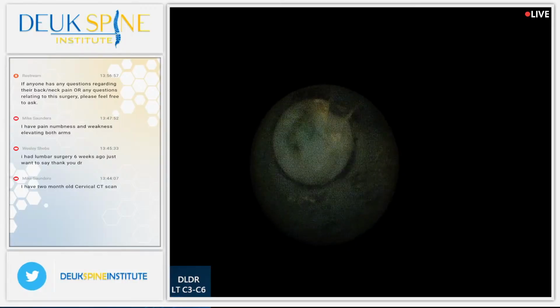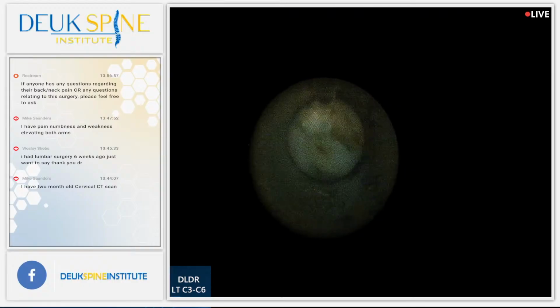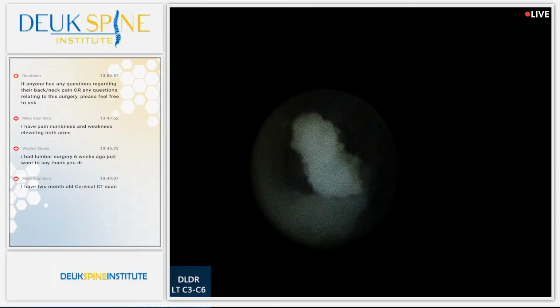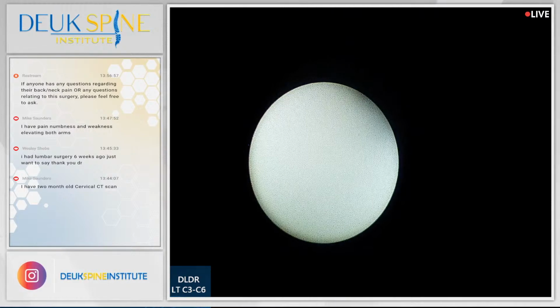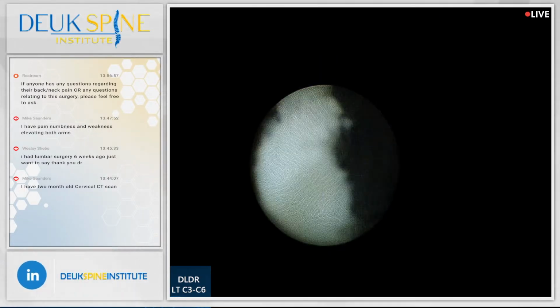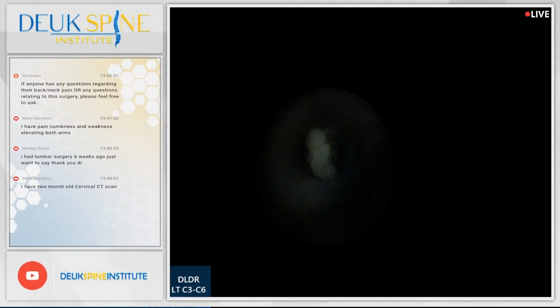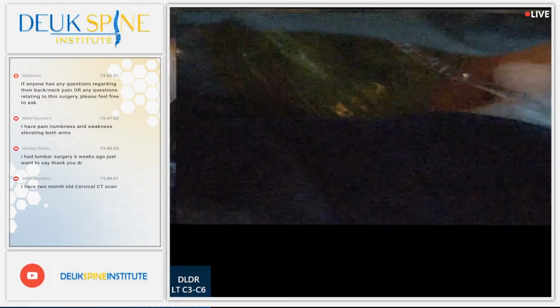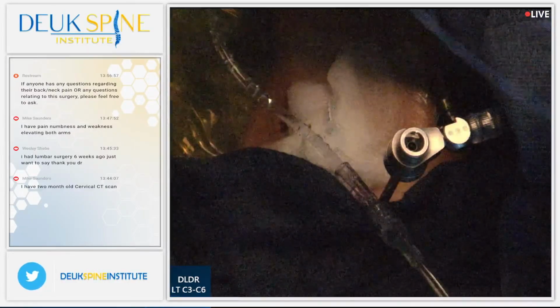You can see that's a big herniation there. There's another piece working its way out. You guys see that? Right there. She must have herniated these one after another. This has got to stop turning. It's got to be this direction or this direction. The fact that it's too much tube is causing it to kink and roll and turn, and that's affecting my ability to get in.